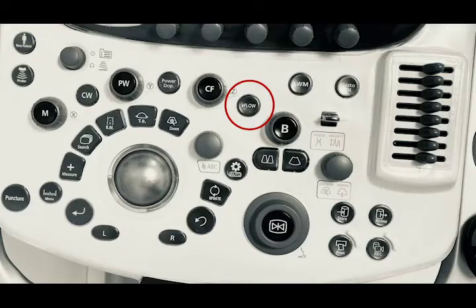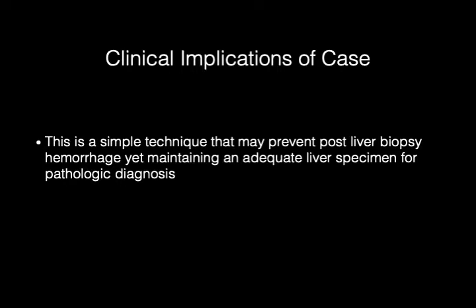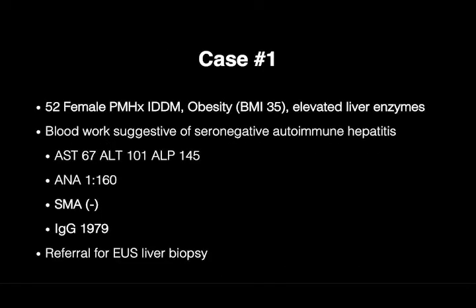This is the E-flow button on the EUS processor that is used to identify flow of blood during liver biopsy. This is a simple technique that may prevent post-liver biopsy hemorrhage, yet maintaining an adequate liver specimen for pathologic diagnosis.